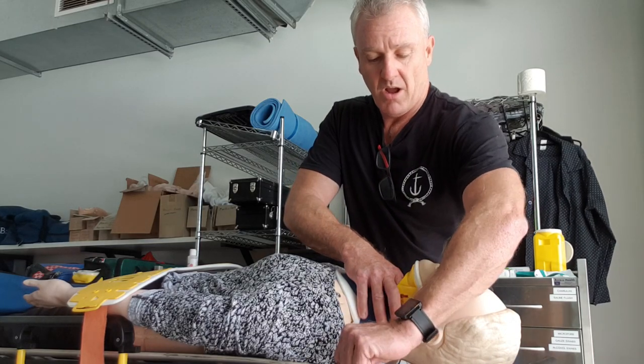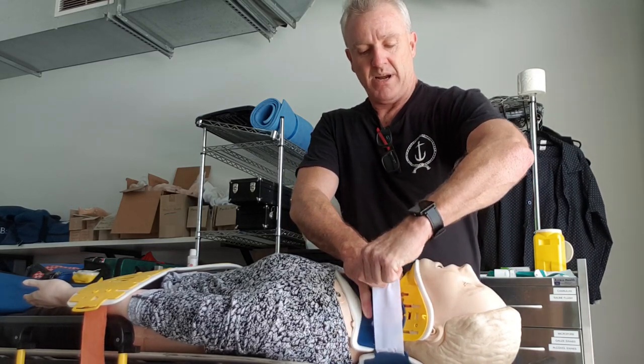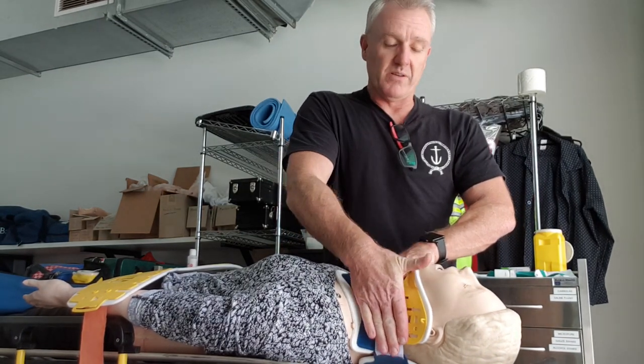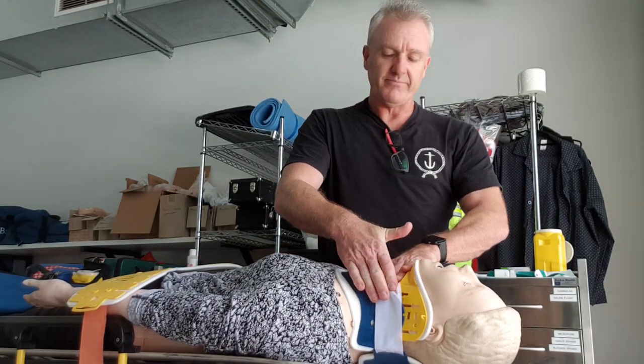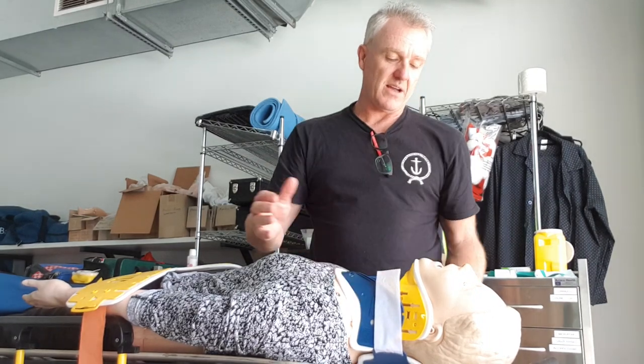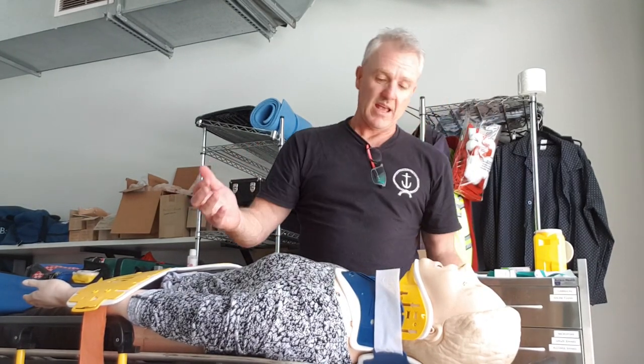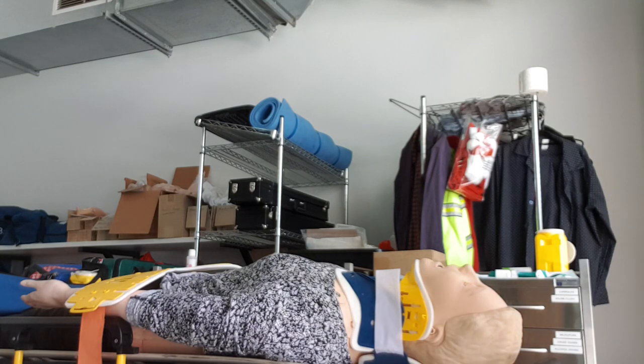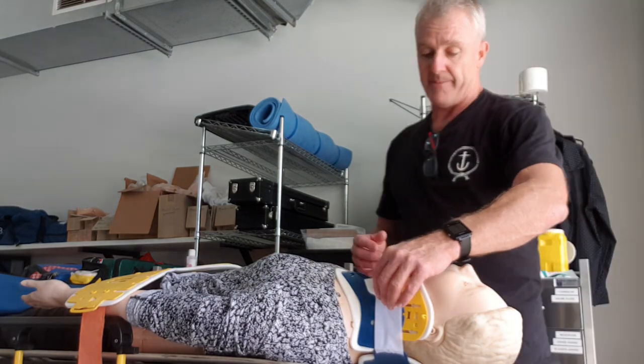At this point I pull, bring the Velcro up and attach it. Make sure that Velcro is locked down. And then that collar's on, and that patient's head is in a pretty neutral position. Hopefully you can see that. It's as simple as that.